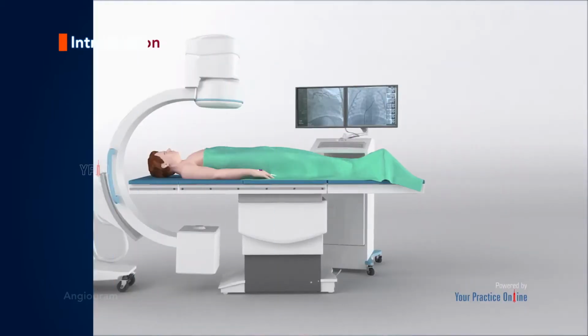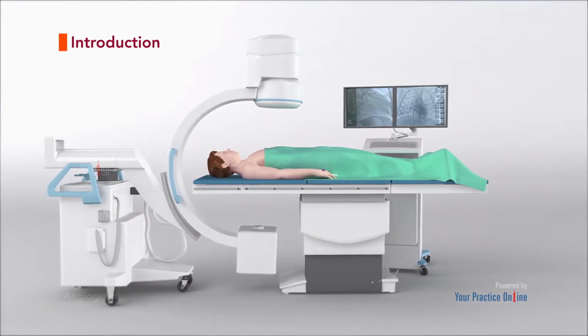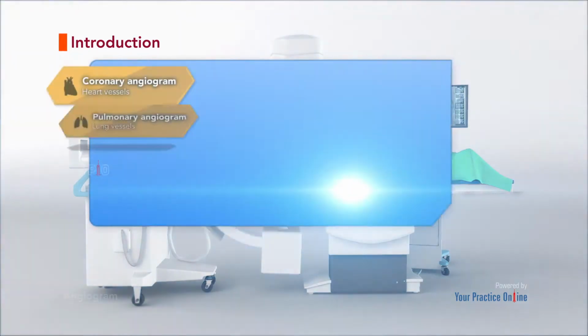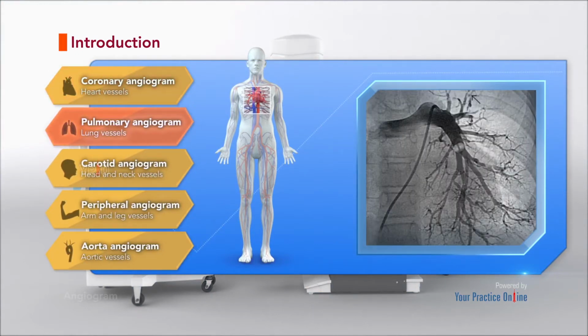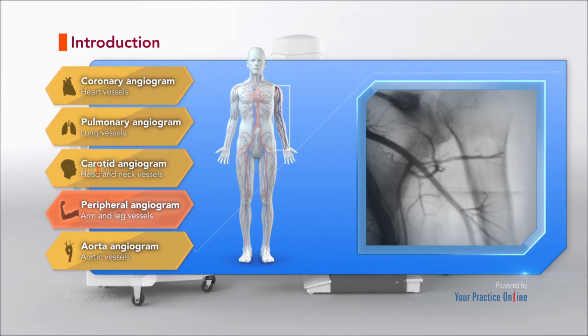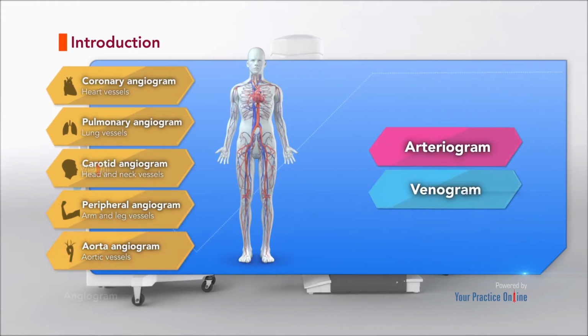An angiogram is an imaging test that uses a special dye and X-ray images to take pictures of blood flow in arteries and veins. There are several types of angiograms, each named after the body part to be viewed. Coronary angiogram, heart vessels; pulmonary angiogram, lung vessels; carotid angiogram, head and neck vessels; peripheral angiogram, arm and leg vessels; aorta angiogram, aortic vessels. An angiogram may be referred to as an arteriogram when the arteries are studied, and a venogram when the veins are studied.